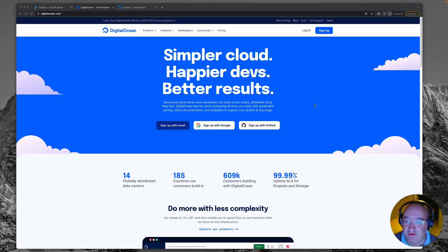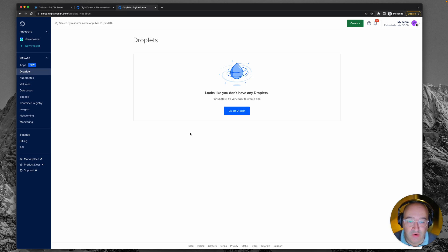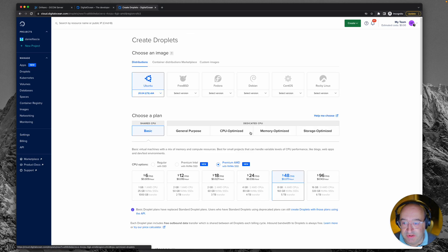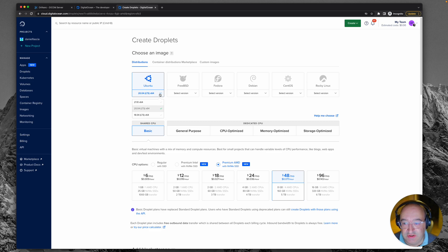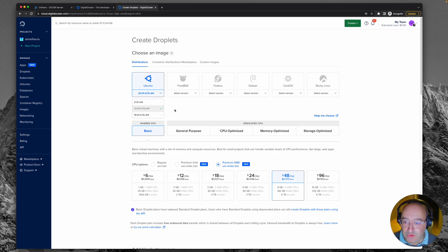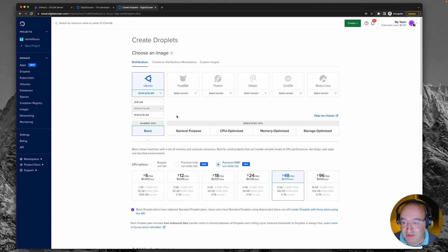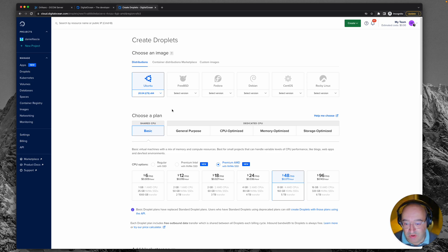So I've logged into my account and you can see I don't have any droplets. A droplet is what they call a little server. We're going to click create droplet and choose Ubuntu. We can pick which version of Ubuntu, and I'd say you don't want one that's too new because Orthanc may not have been updated to work on that yet. I'm going to stick with version 20.04 LTS, which means it's from 2020 and LTS means long-term support.